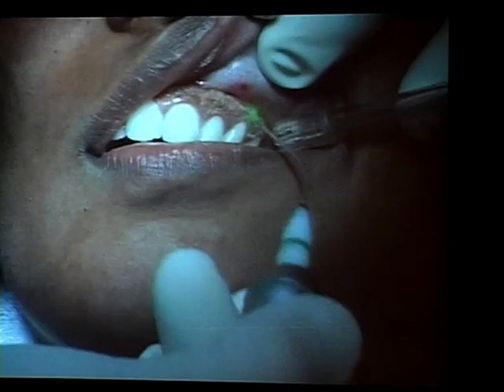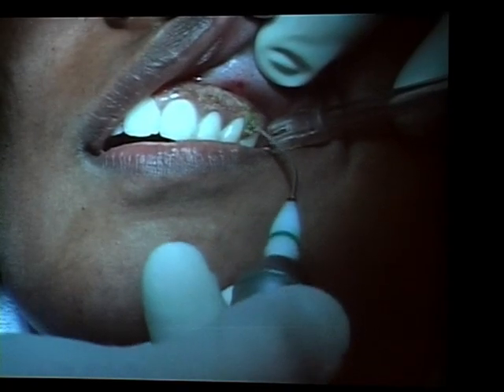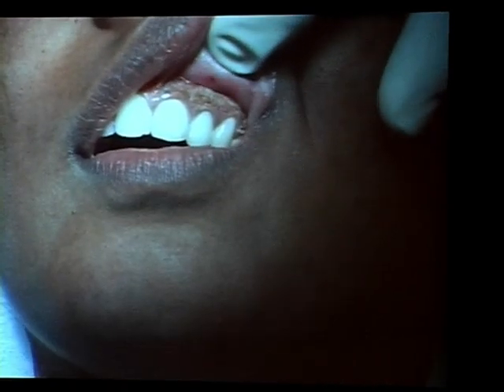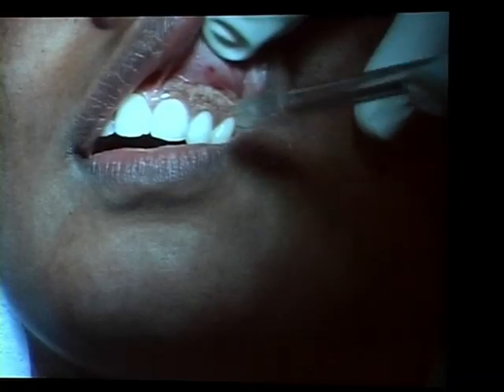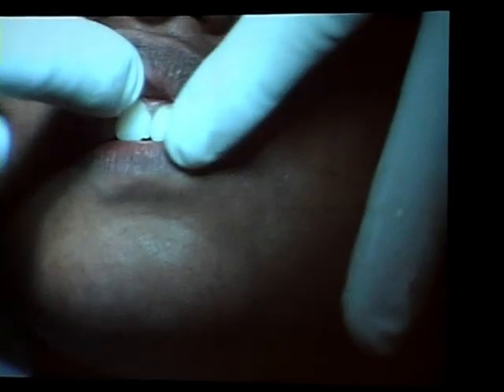And you see there is an all-time good coagulation, absolutely no bleeding. We need higher powers. And you have to go layer for layer over the tissue. You cannot remove everything at once. So you go like this, like this, like this. And thickness-wise, you go like this. Just touch the whole area and then control it once again. And if necessary, do it again.